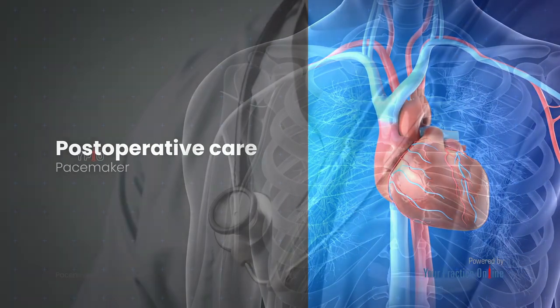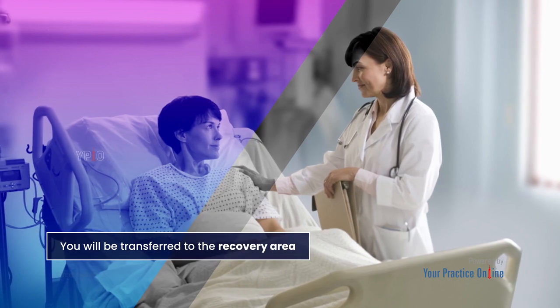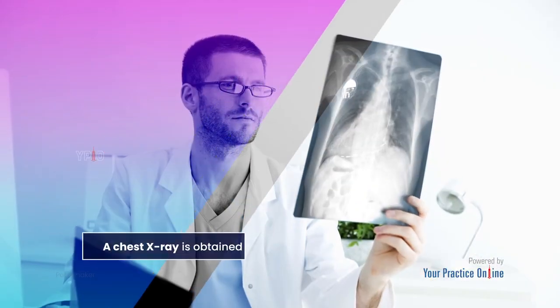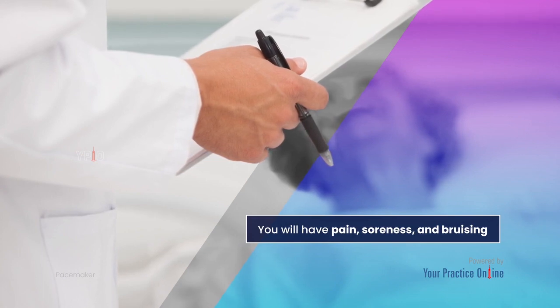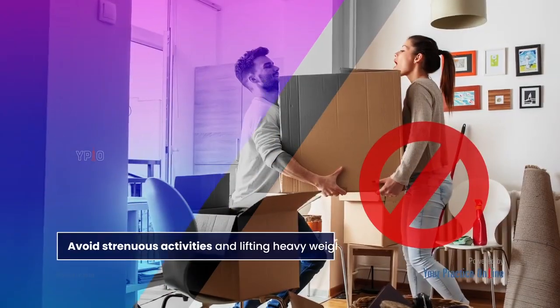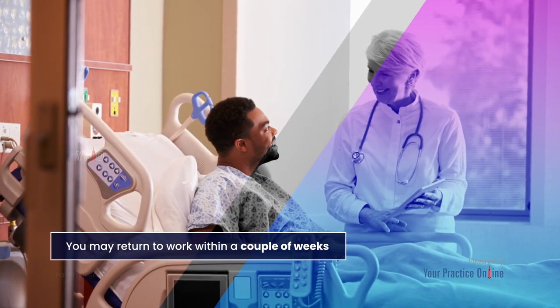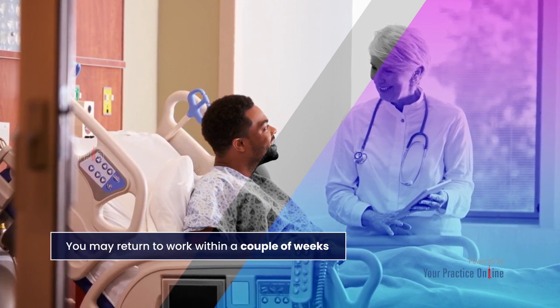Postoperative care. Postoperative care instructions following a pacemaker implantation may involve the following. You will be transferred to the recovery area where your nurse will monitor your vital signs, including heart rate and rhythm. A chest X-ray is obtained on the morning after surgery to confirm the pacemaker and leads are in the correct position. You will have pain, soreness, and bruising around the incision site. Medicines will be provided as needed to address these. Instructions on incision site care and bathing will be provided. Avoid strenuous activities and lifting weights heavier than 10 pounds. You may return to work within a couple of weeks, as well as resume your normal daily activities within a few days, but with certain activity restrictions.